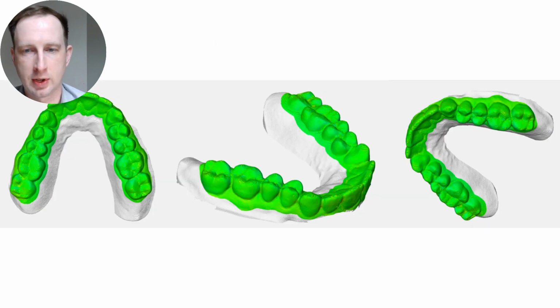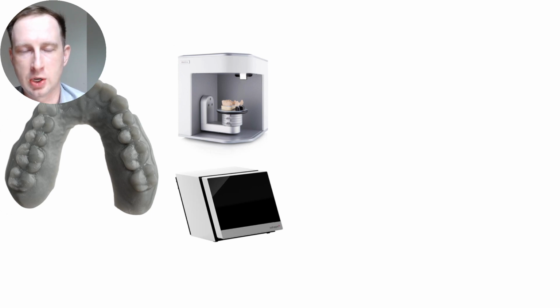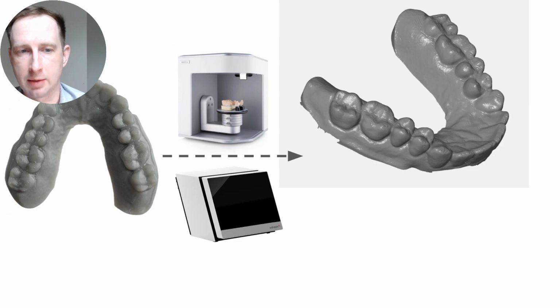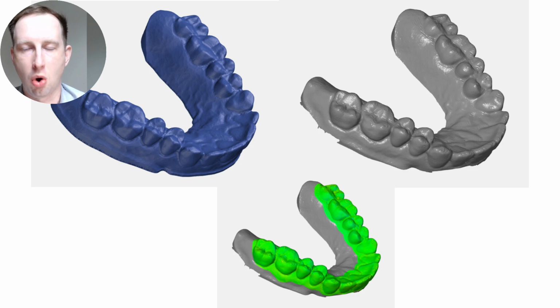So really fantastic. To get to the accuracy, we always do a lot of validation and testing. We do a lot of prints and a lot of scans, and we compare those scans to the original file. What does that really look like? Here's our manufacturing file for our metal master model. We print it. We then use a very high precision desktop 3D scanner, which is accurate within 8 to 10 microns. And with that scan of the model, we compare it to the original manufacturing file. We overlay those two and ask, in the print compared to the original, how much deviation on the surface do we have?